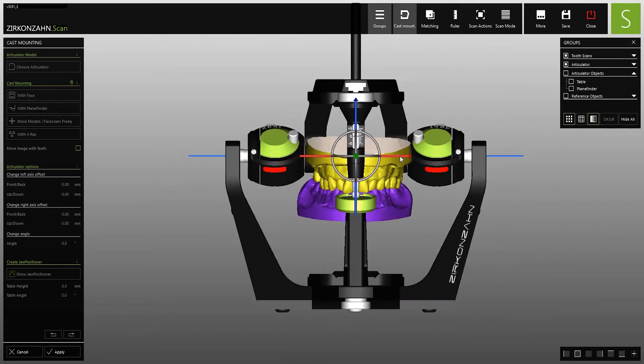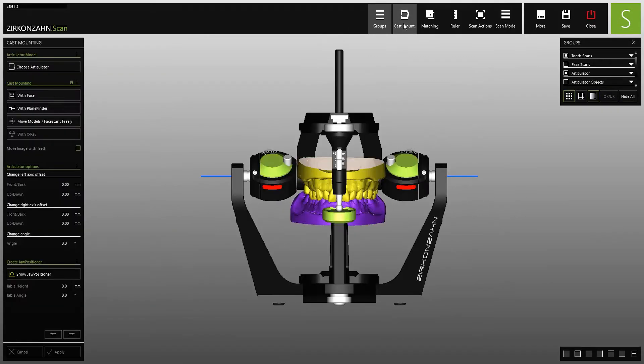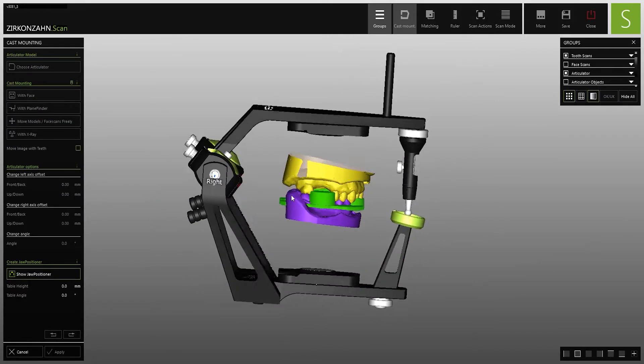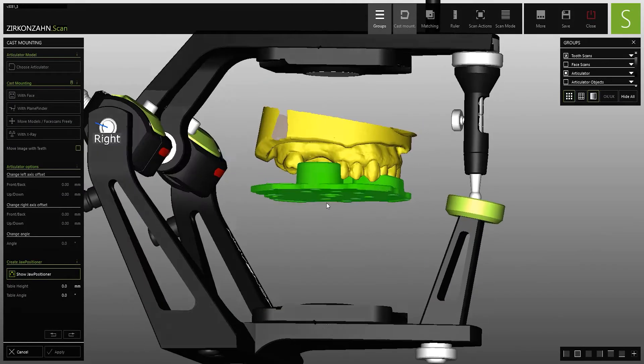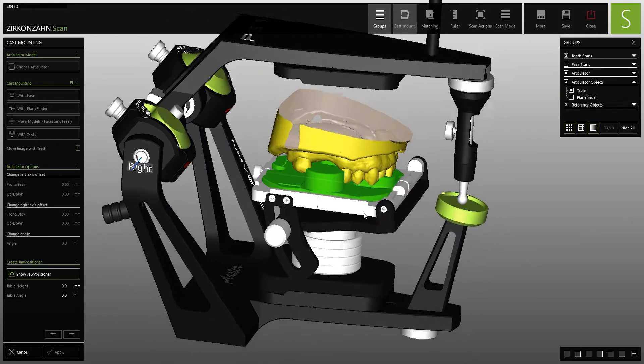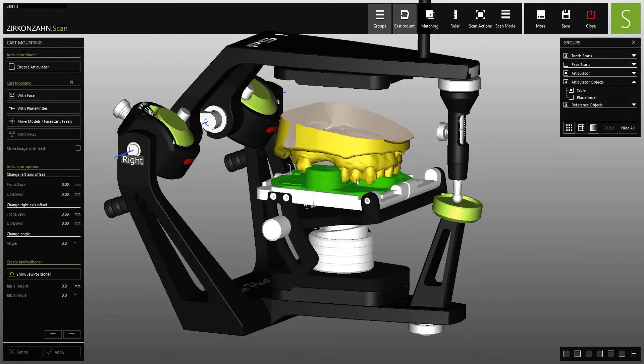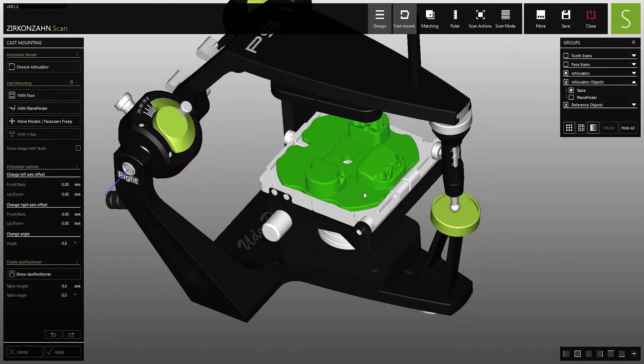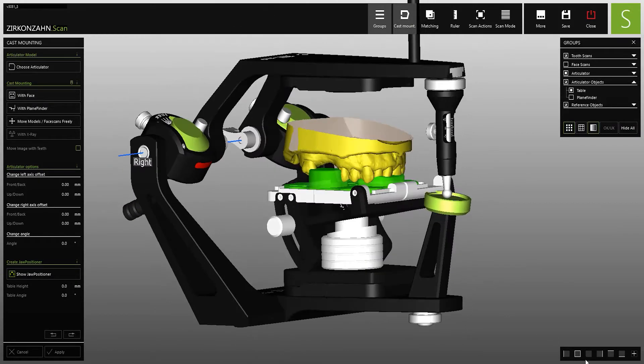Using the so-called jaw positioner, you can then transfer the digital position into the physical articulator. In this case, a positioning pattern of the upper jaw can be milled out of the jaw positioner with a Zirconzon milling unit and then placed on the plane positioner. This allows you to reproduce the virtual position in analog form.